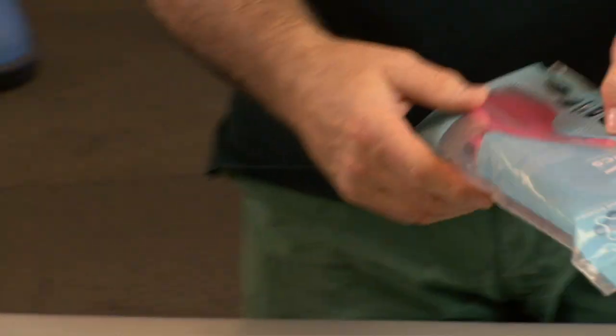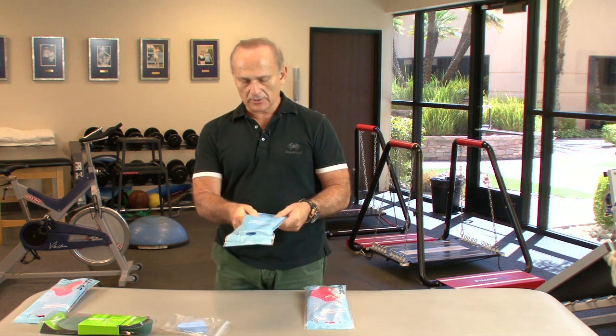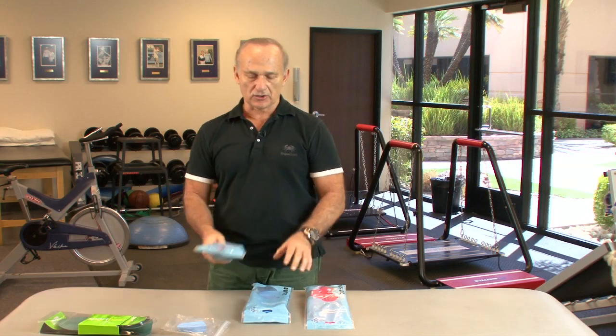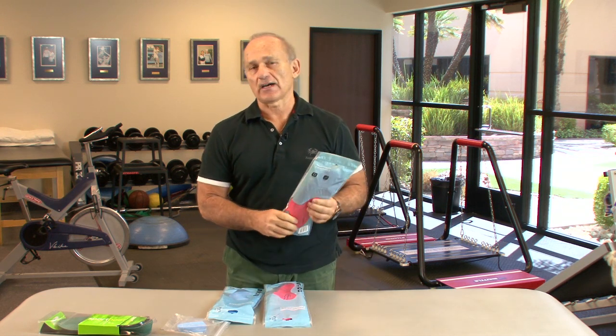You can pick the density on these different products, and we have 3 different densities here that we can review. There's this really firm orthotic, single firm, and we have the single medium. Then we have a dual density, which is a combination or halfway between these two. These are the main 3 I've been using for the past 3 or 4 years. The hard, firm orthotic is for those patients that really can tolerate that firm orthotic.